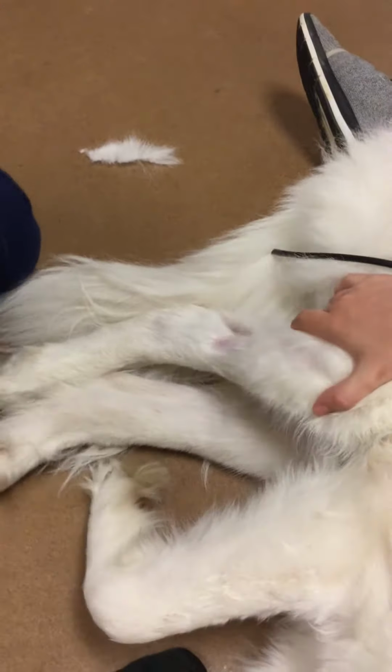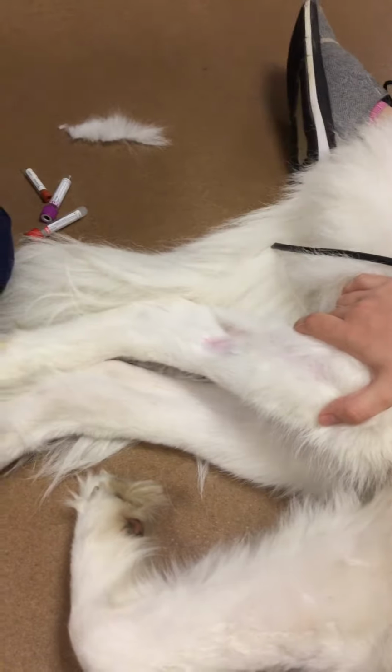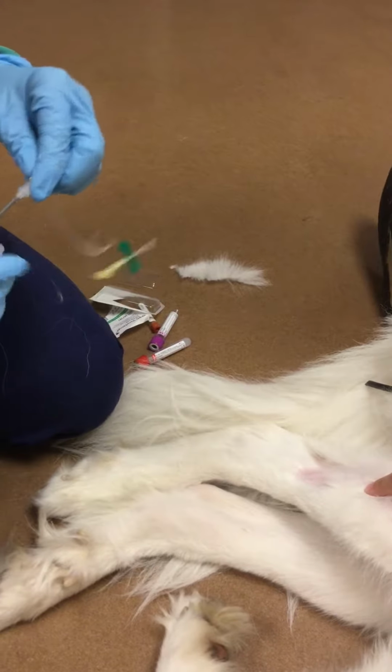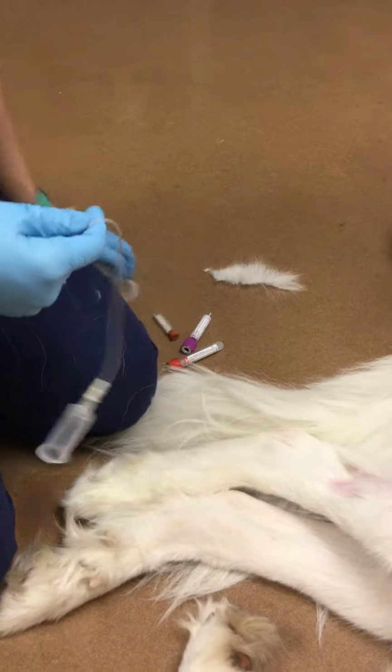And I'm going to use a vacutainer. So this part connects to here. My tubes are right here.